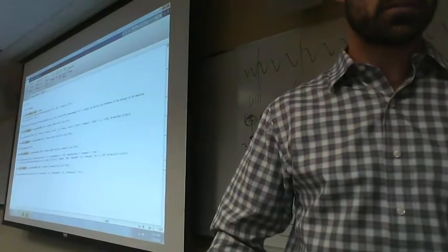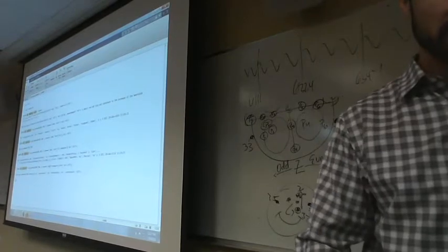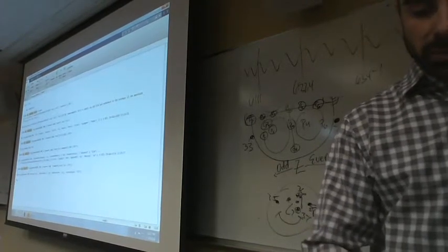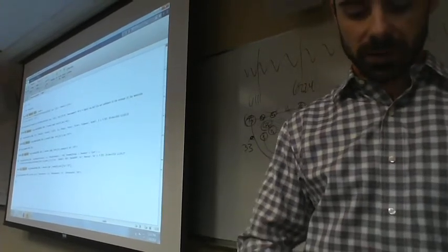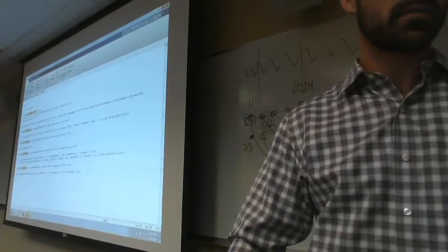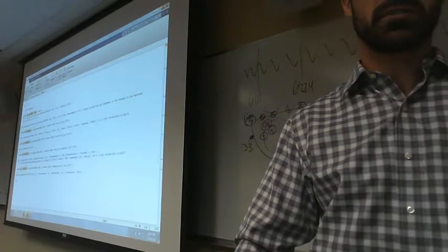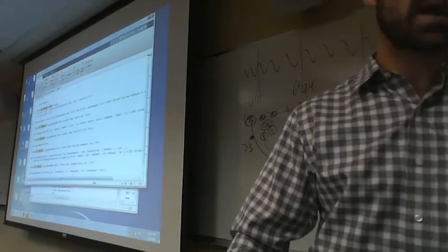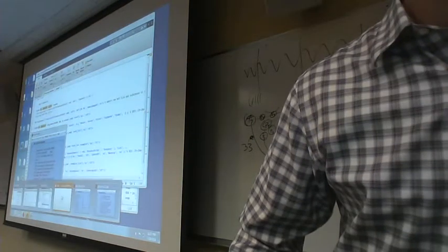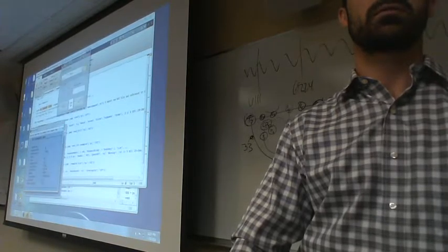I'll just take this, open bracket, add the word subj, delete the 3, make it an underscore actually because MATLAB doesn't like to read spaces, and close the bracket at the end, just like that. Okay, now it also has the part in here about deleting our events, and now what we can do is come back to our GUI, and we can extract bin-based epochs.